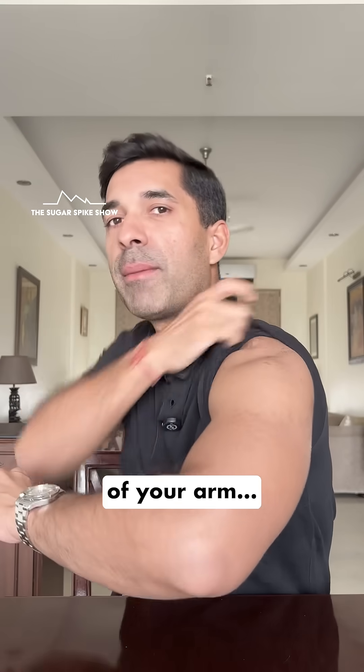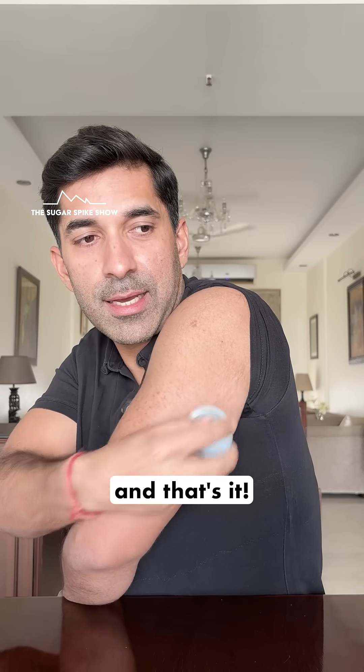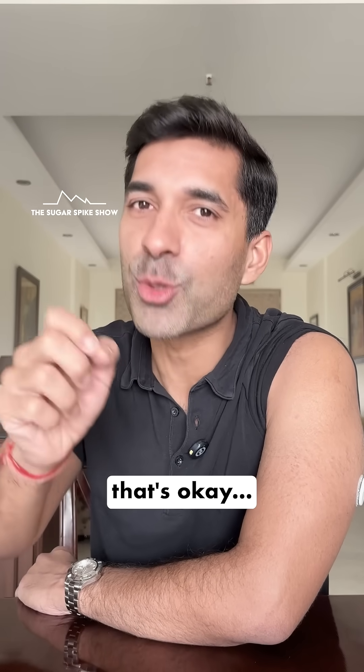Then find a spot on the back of your arm. Make sure it's clean and punch it in. And that's it — it doesn't hurt, it only pinches a little. That's okay.